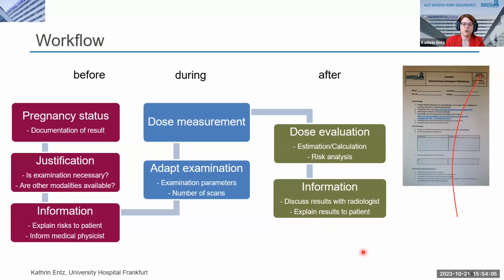And what is also a very good idea is to have something like this. It's a checklist where we have everything step by step, so that even young doctors, young radiographers who have not much experience know what to do, because these cases are also seen during the night, on the weekends, when there's not much personnel, when there are only the inexperienced people. So you can use this formula here and go just step by step. And so everyone knows what to do.